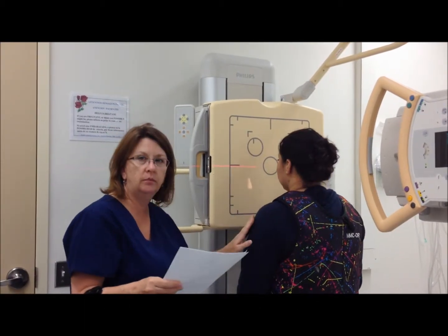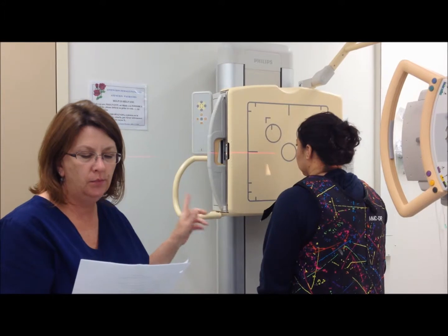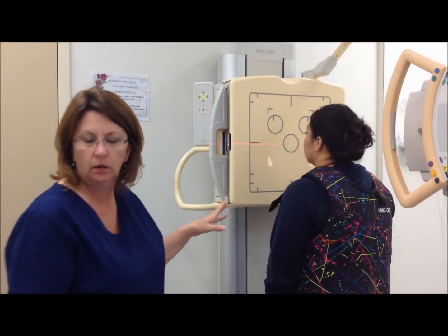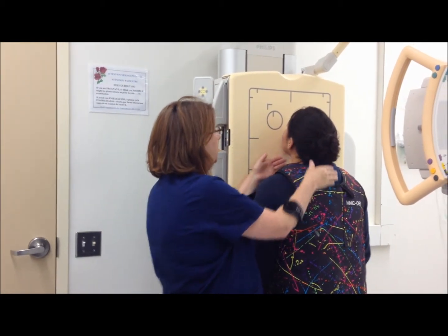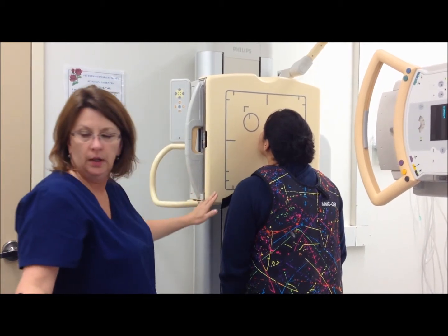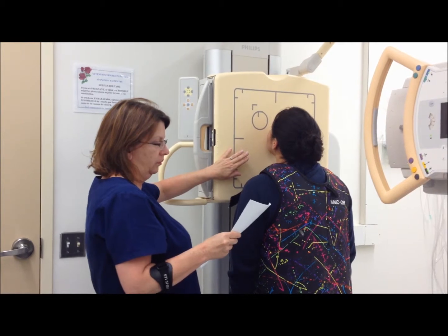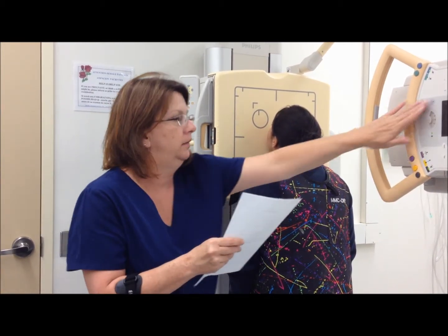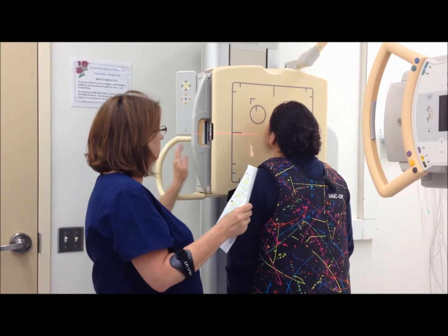Okay, for my next image, we're going to be doing a Waters view, also on an 8x10 cassette. The patient is going to have her chin on the board, the OML 37 degrees to the IR. The CR will be horizontal and exit the acanthion, centered to the IR.